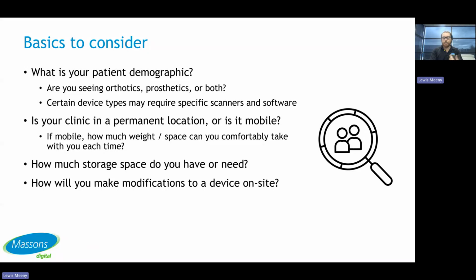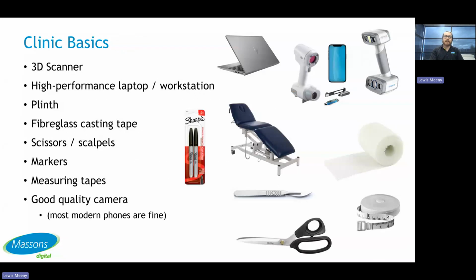In terms of heating it up, adjusting edges, what is it that you're going to need to do some basic trimming? So really, when we break it down to clinic and workshop basics, this is just a smattering of clinic basics. It's not necessarily a covering be-all, end-all, but essentially it's saying if you have a scanner, a good laptop, a place for patients to sit, and a capacity to cast them, that is your absolute basics for getting set up with a CAD/CAM enabled practice.